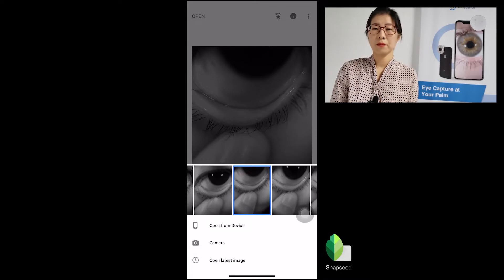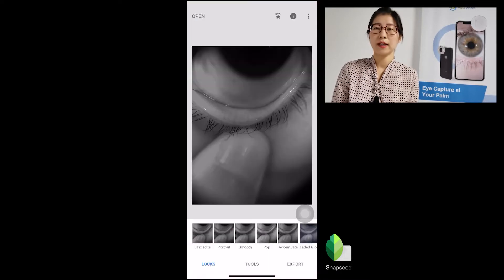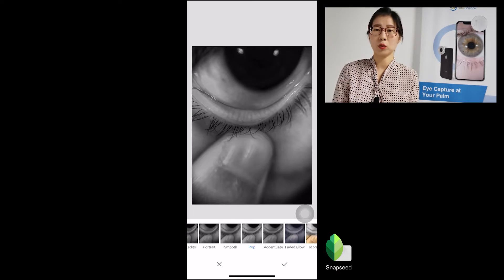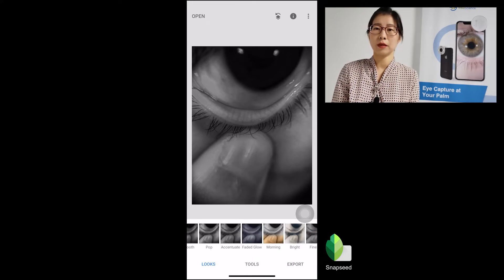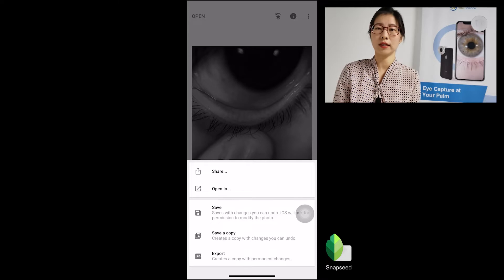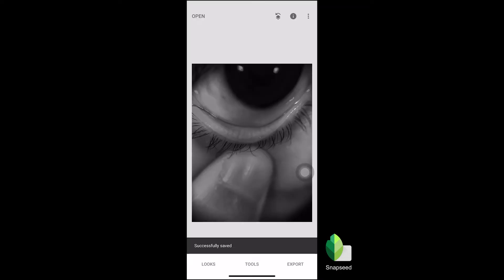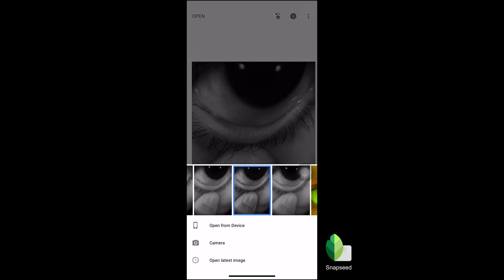After capturing the meibomian gland image, we would suggest downloading an app called Snapseed. It is an excellent image processing app. When you open this app and import the image you just captured and select the pop or accentuate mood, you will see that the images are enhanced and the meibomian glands are more clear than the original image. So much for the meibomian filter.